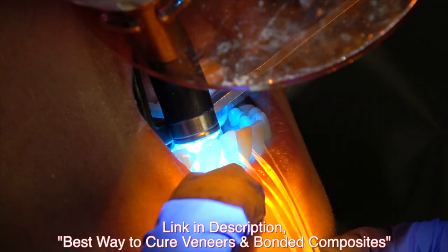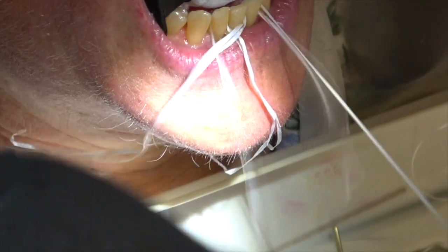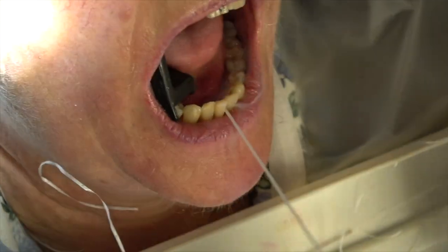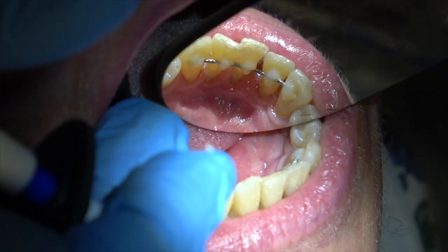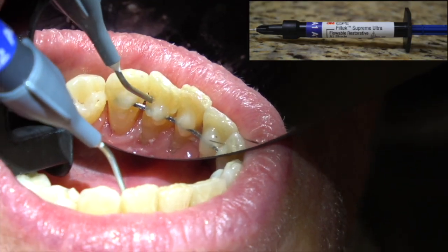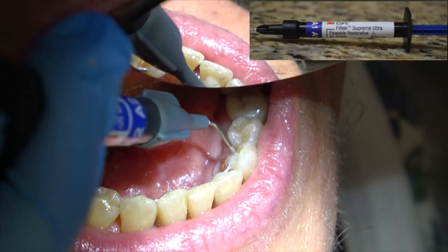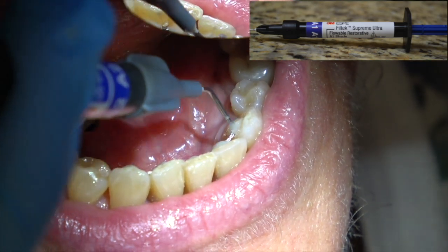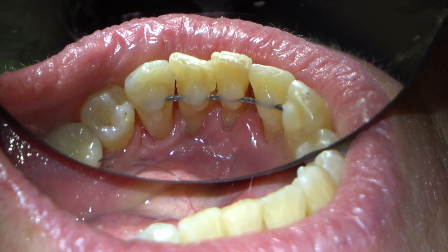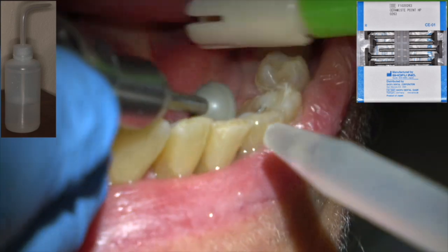Then we're going to come back and polish that filled resin once we cure it. Cure it with a curing light, then add a little bit more to idealize it. You can contour it with a flame-shaped diamond, a chamfer diamond, or a football diamond. You can also use a polishing strip.